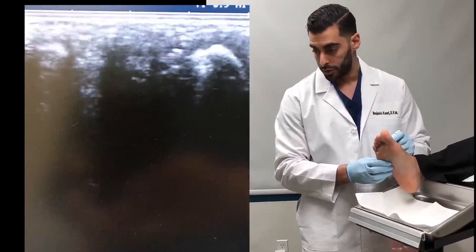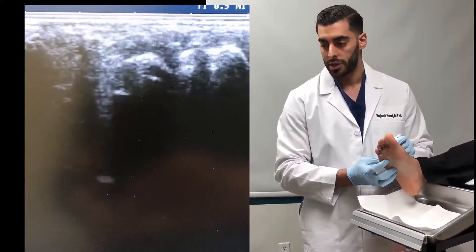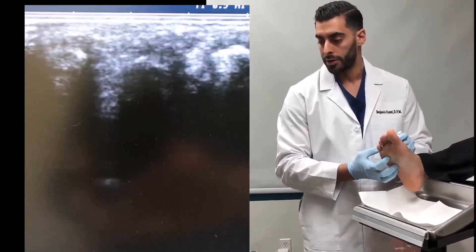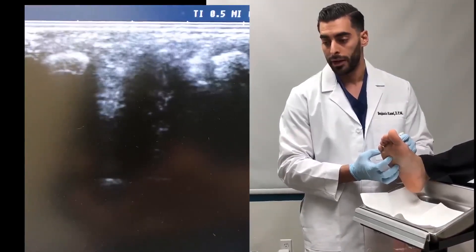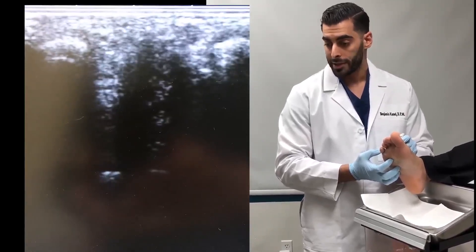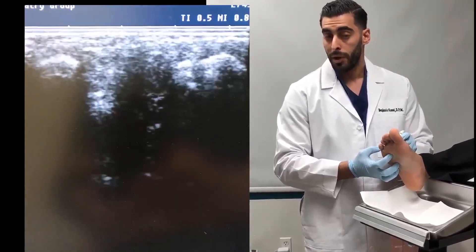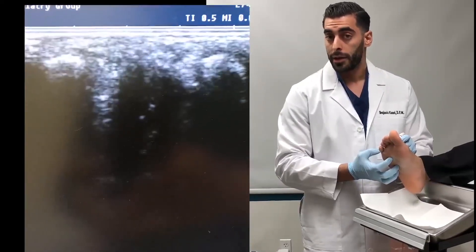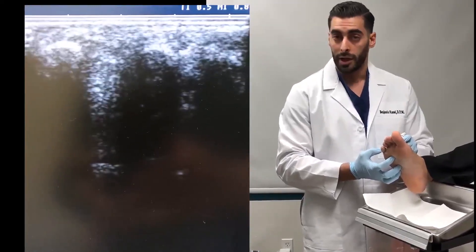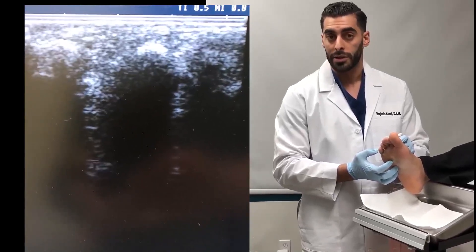From the dorsal aspect, let's do a transverse view. You can see the metatarsal heads just the same, and what's beautiful about the ultrasound machine is that it's a dynamic imaging modality. As you can see, I am palpating in the intermetatarsal space and I can see those metatarsals separating or moving. Now, if you do see a round hypoechoic mass and you think it's a neuroma, it may also be an adventitial bursae. If you were to press and it were a bursa, you would see it collapse. However, if it were a neuroma, you would see it translocate a little bit. In this patient it's normal — just uniform hyperechoic fat — but I will show you a few images of some abnormals.